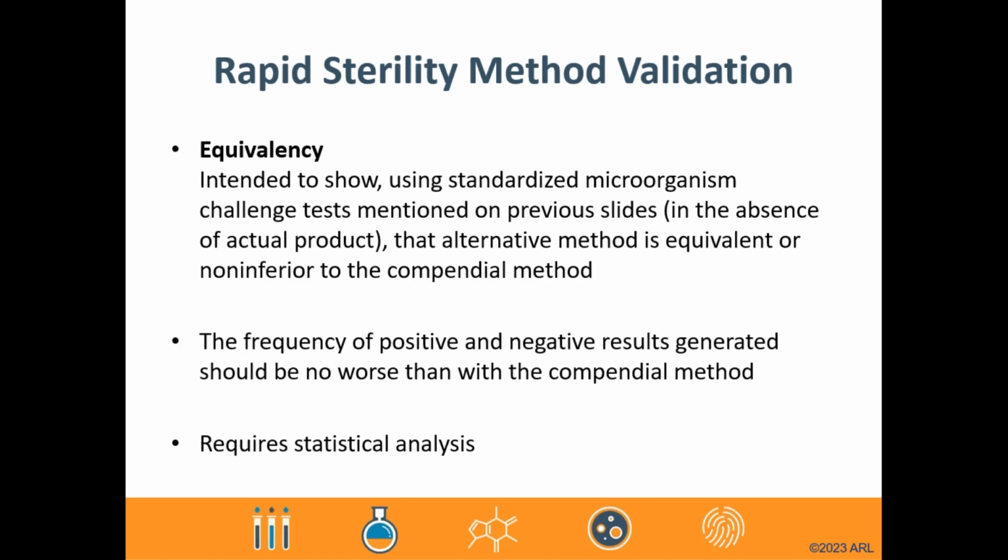Ultimately, the aim of all this validation protocol testing is to demonstrate the acceptability of the alternate procedure relative to the current microbiological practice. To do that, the laboratory must demonstrate that the new procedure is as good as or better than the current procedure in terms of the ability to detect the presence of microorganisms. This is determined to be the equivalence.